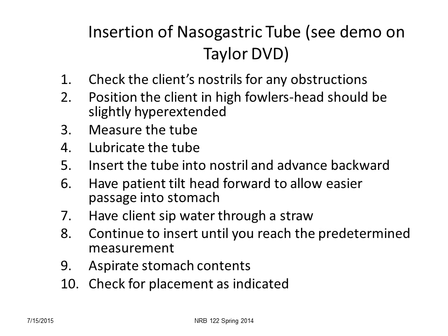Now, on your videos, there is a nasogastric tube insertion on the Taylor DVDs. I want you to look at that, and also in class, we're going to be reviewing that, and I'm going to show you on the mannequin how we actually insert a tube. And I have a great video from England, which I think is even better than the Taylor DVD, that I'm going to show you because it's very realistic how the patient reacts.